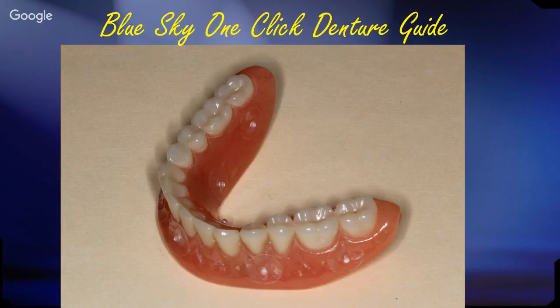Sure. It should definitely be checked in the first couple of cases, but definitely work went into that. All right. So yes, we found great accuracy from a stone model versus VPS. Some people like the stone model technique work better. But of course, the fewer steps we have to do, and if we don't have to pour a stone model, that's great too. So these are the stick-on beads that are sold on Blue Sky's website for doing the denture technique, or the scan appliance technique using a denture.